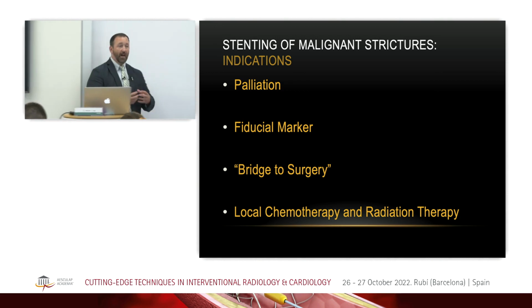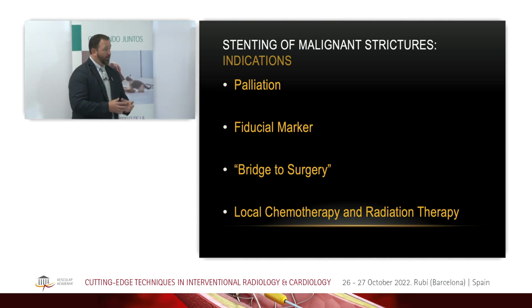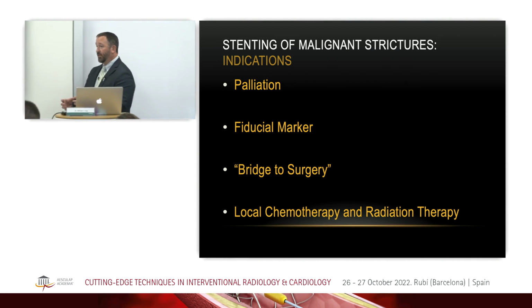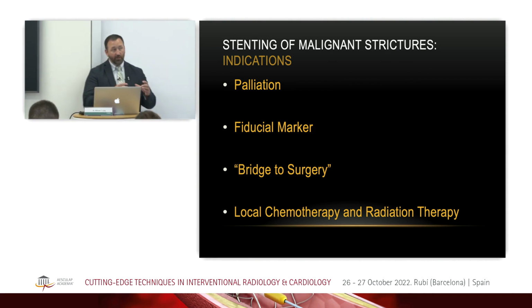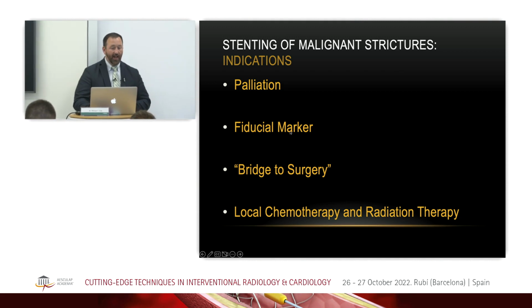And so if you're doing a high dose radiation therapy directly to that prostate tumor, you get worried about missing it. You get worried about potentially treating some of those other structures around it, some of those other organs around it. And so what you can do is you can place a urethral stent that's not going to move, that's going to be in the same location as the prostate at all times, and you can use that as your guide.